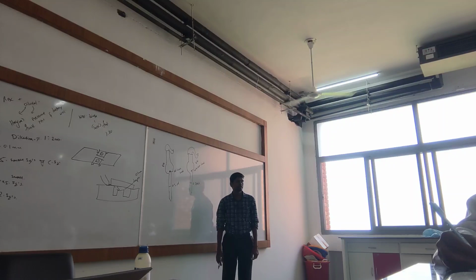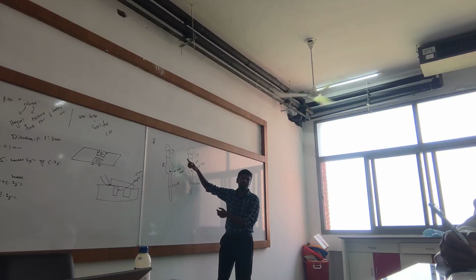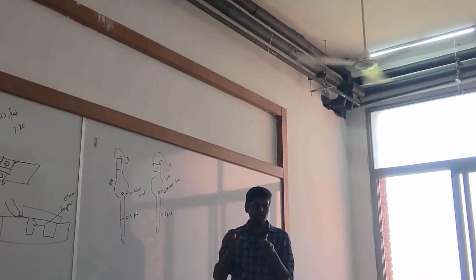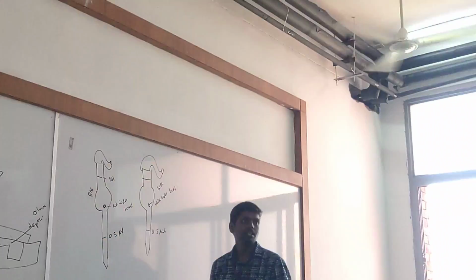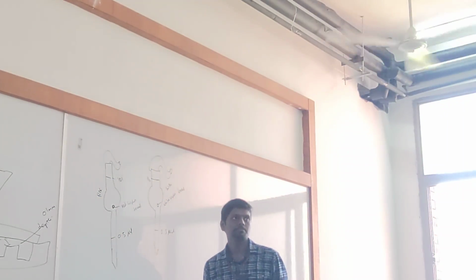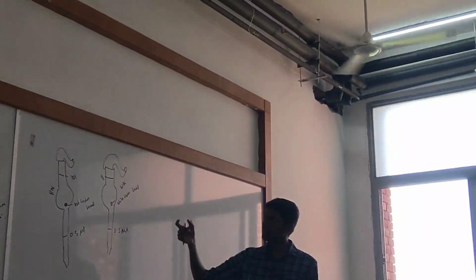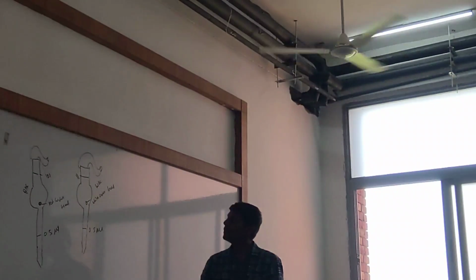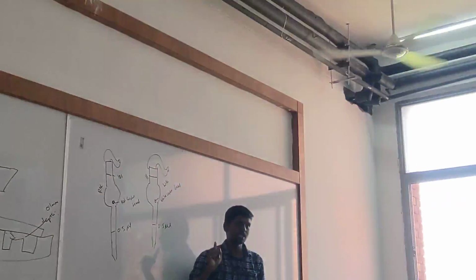Is it clear? Yes. Then, there is an upper marking above the bulb. The upper marking is very important. The upper marking for RBC is 101. Very, very important. Whereas for WBC, the upper marking will be 11. So these are the important markings of the equipment. 101 for RBC, 11 for WBC.